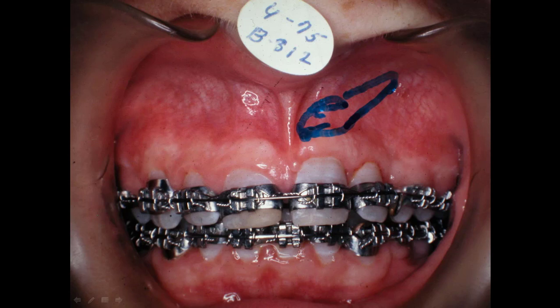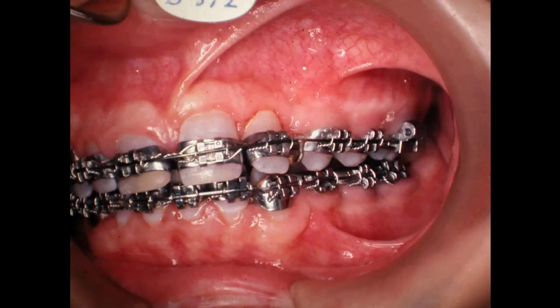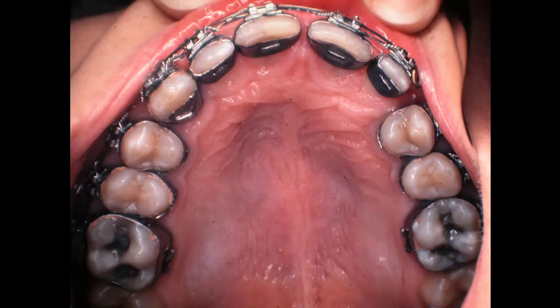And taking the bands off was a tedious thing. Boy, I clipped that one and I got it off there with as little effort, as little force on that tooth as I could possibly do. So we don't show the orthodontics. We've done a lot of that. So now we have started moving these teeth up, and we'll close these spaces. But you can see the palate going up and kind of turning over this way. So we're going to have a midline that's kind of off in the case and finishing it out.